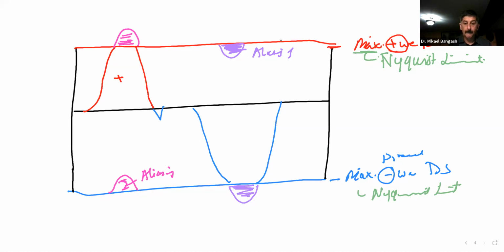Whereas in negative Doppler shift, aliasing or not, you may have a slight positive Doppler shift. Here it is going to be close to your zero Doppler shift line. From negative, you get a slight positive Doppler shift. From positive Doppler shift, you have a slight negative Doppler shift.